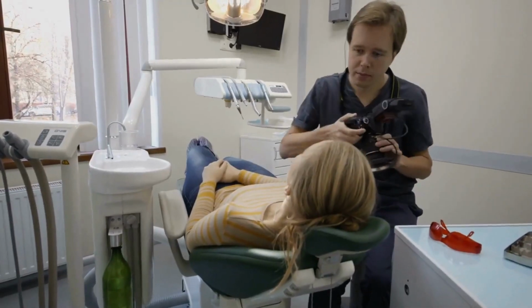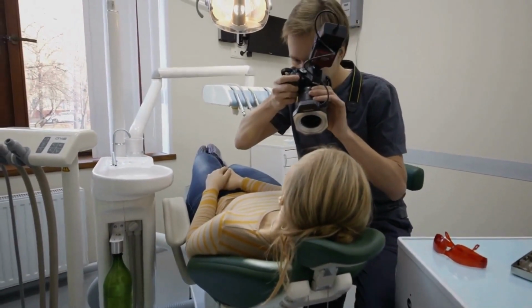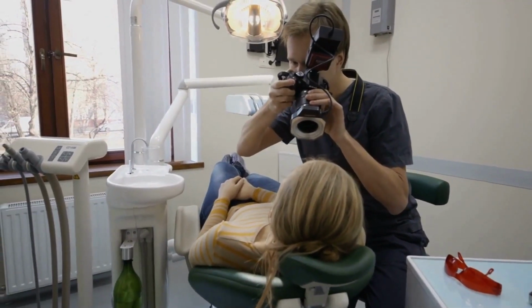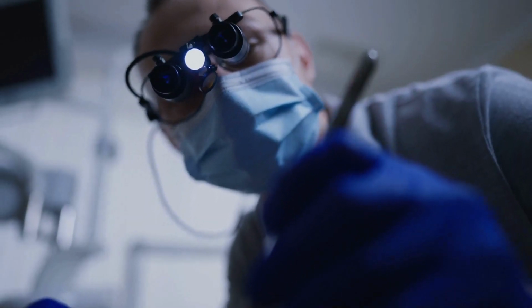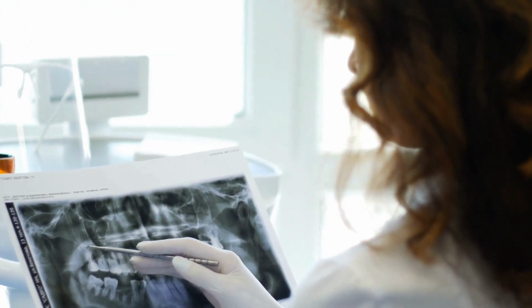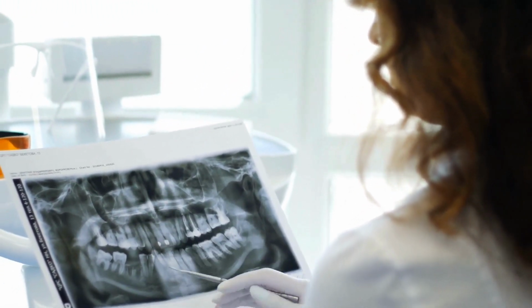In the context of dental photography, this twisting of light waves occurs when light interacts with the complex structures of teeth and oral tissues. Enamel, with its crystalline structure, and other oral tissues with their varying densities and compositions, affect the polarization state of light as it passes through them. By filtering out all other light, cross-polarized photography captures only the light that has interacted with these structures, revealing their unique optical properties and highlighting subtle variations that would otherwise be hidden.